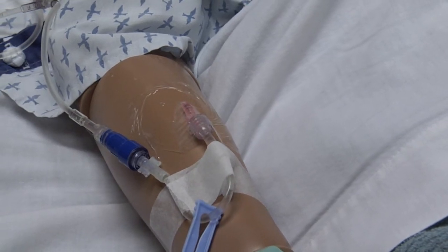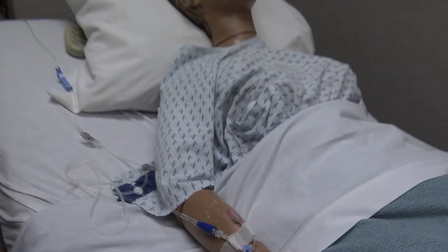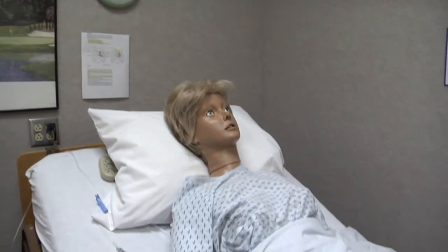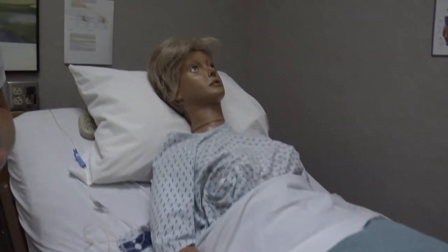So when we're monitoring, we always work from our top to the bottom of the patient, and we'd come back in an hour and make sure that all of the things that we talked about are in place. And then the final thing that I would do is my documentation that yes, indeed, I was here and I did check this IV and everything is running fine.